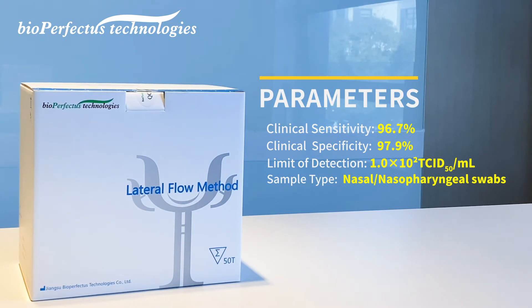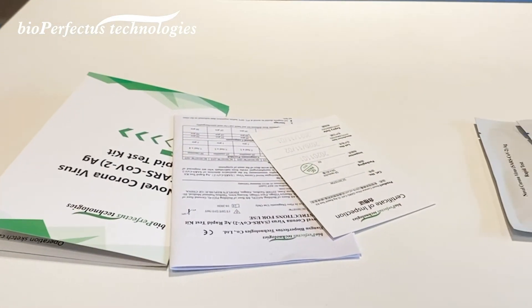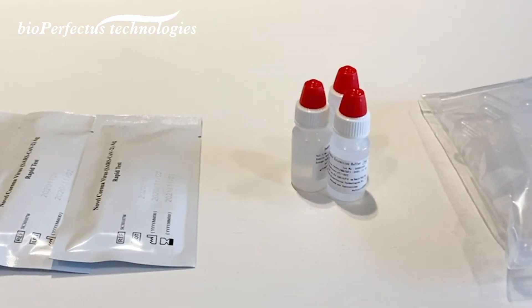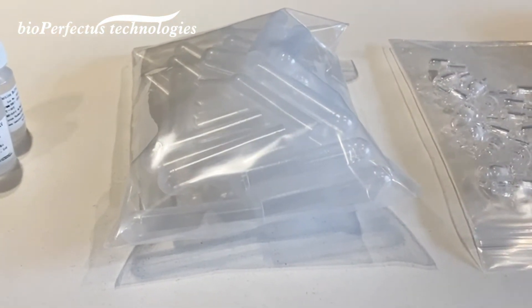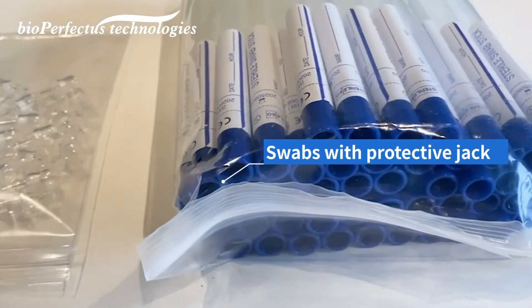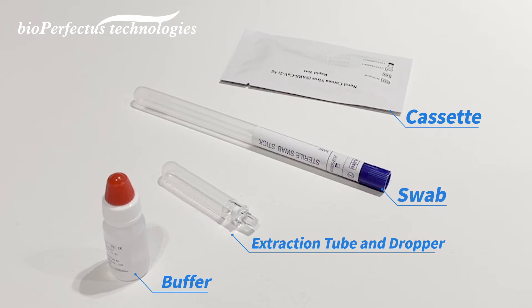In one box you have: operating card, instruction for use, certification card, cassette, buffer tube, dropper, and swabs with protective jackets. Before testing, prepare the components required for a single test: one swab, one cassette, and one extraction buffer.